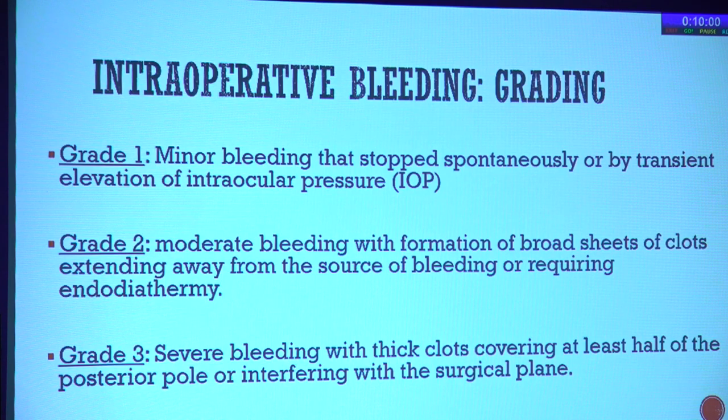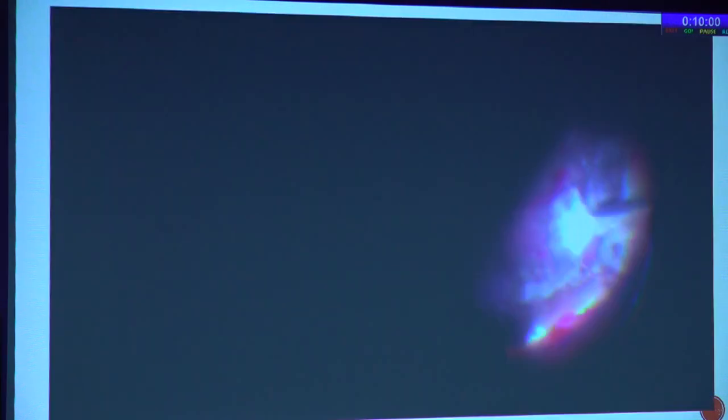Intraoperative bleeding can be graded as mild, moderate, severe. I'll not go into the details here. This is the first video just to show you.